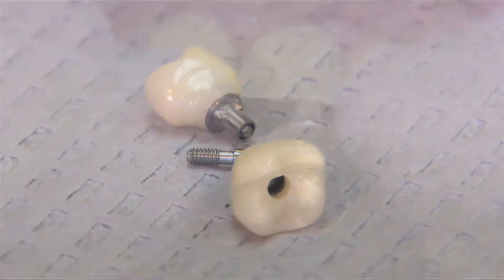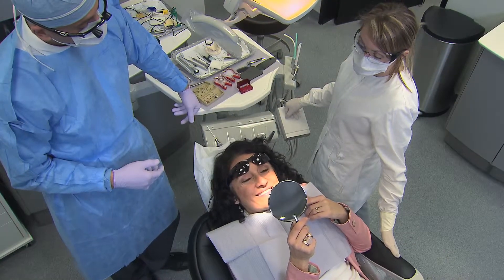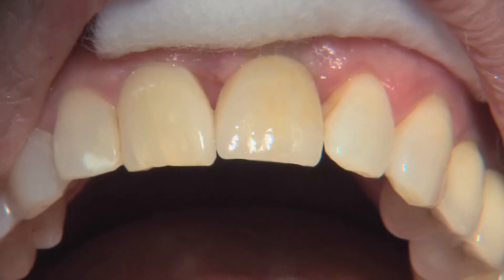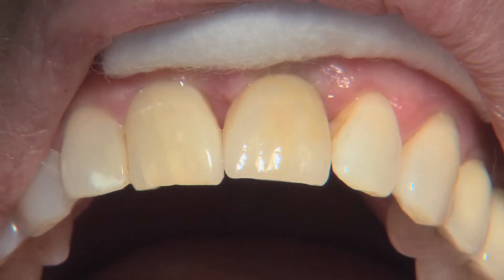In this installment, we will take a look at screw-retained crowns. I have found many benefits of using these one-piece alternatives instead of their cemented counterparts. In my experience, Bruxer Solid Zirconia screw-retained crowns are convenient and eliminate the possibility of porcelain fracturing off.